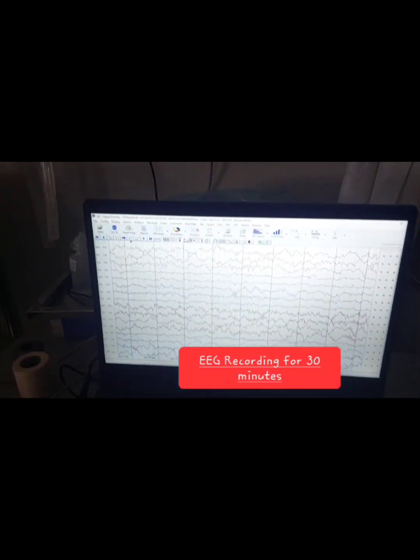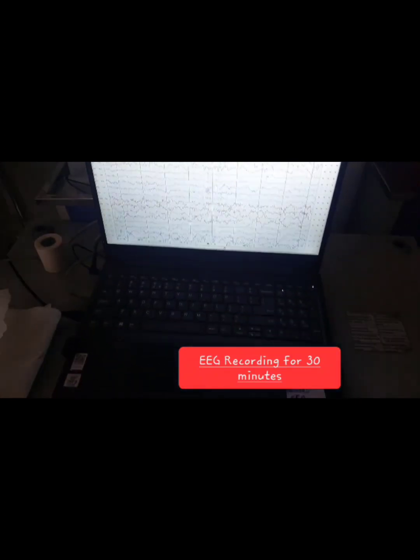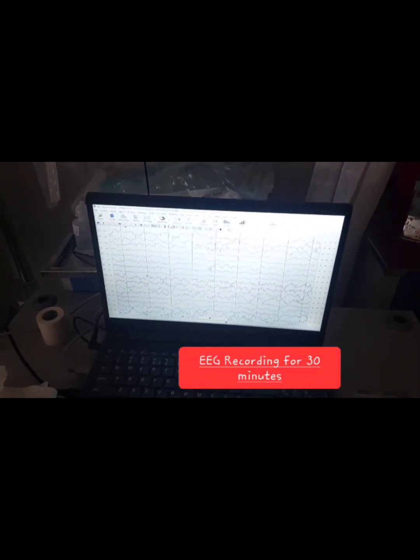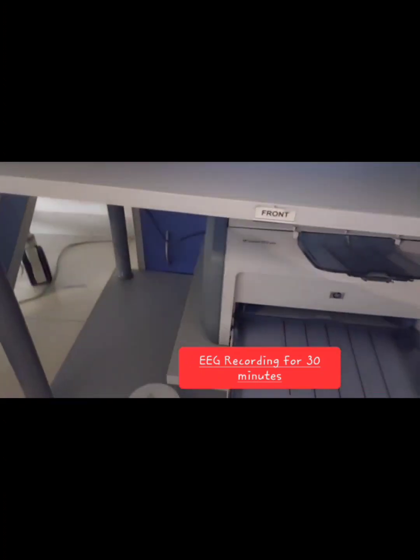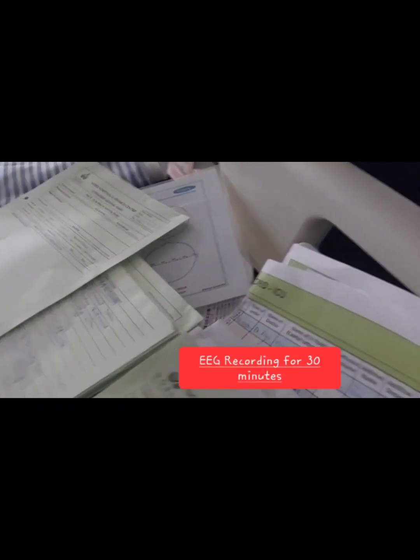So here you can see the waveforms, electrical waveforms in the brain, and these activities we have to record for 30 minutes, and we have to take a print. The printer is also connected here. So for this patient, we have just taken the print.